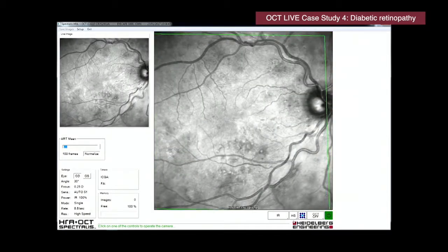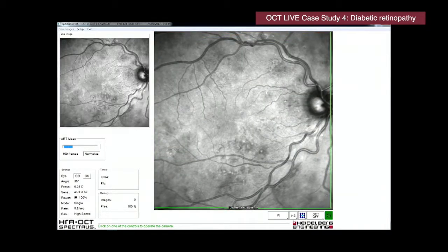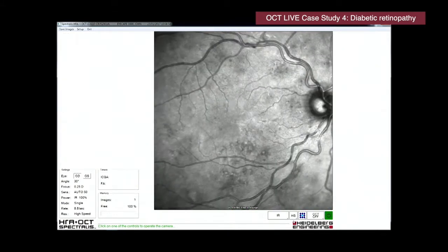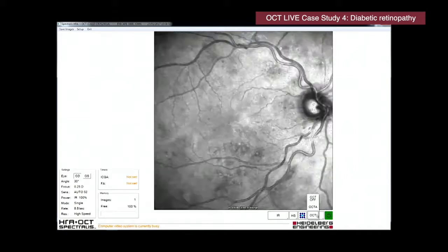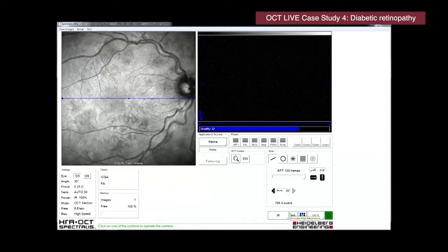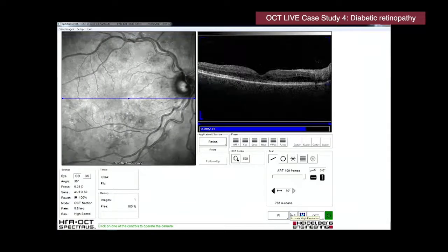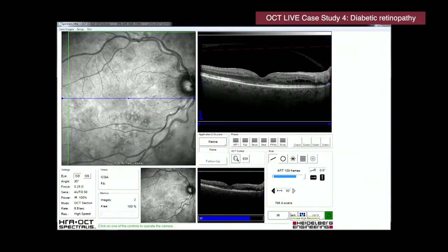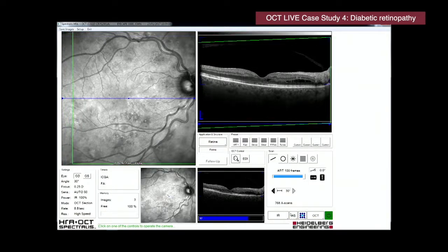Right, okay, so once again, the infrared reflectance image is highlighting a lot of changes here. So we can go on to the OCT now, Phil. And again, we can start to utilize information that we have here. So we start out with a straightforward macular-centered line scan. We track, acquire an image, and then simply where we're seeing a change.